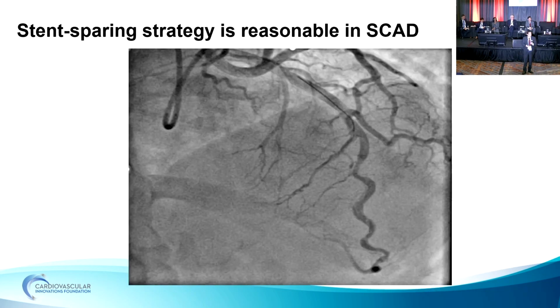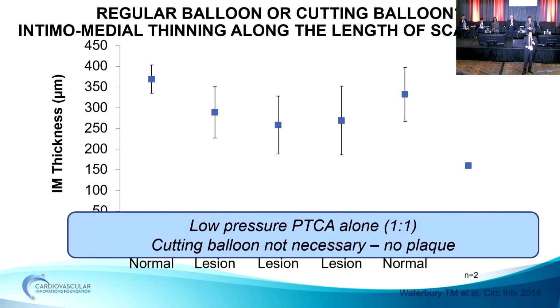And with balloon angioplasty, would you just do regular balloons? There's some talk about cutting balloon, trying to treat the hematoma. Yeah, so the next slide, the cutting balloon is all very good theoretically. It comes from the CTO world you spoke about, and in the CTO world, it makes a lot of sense.